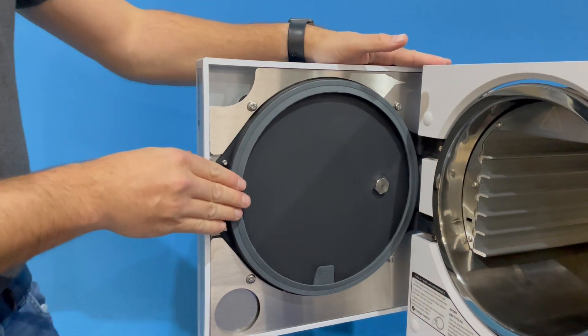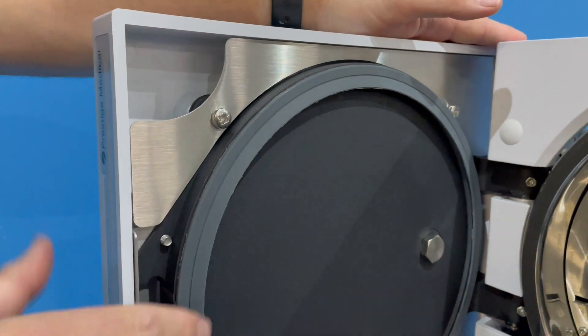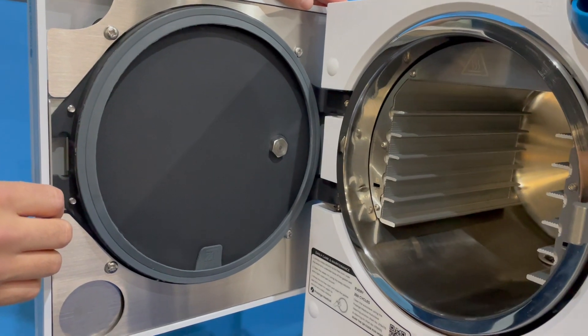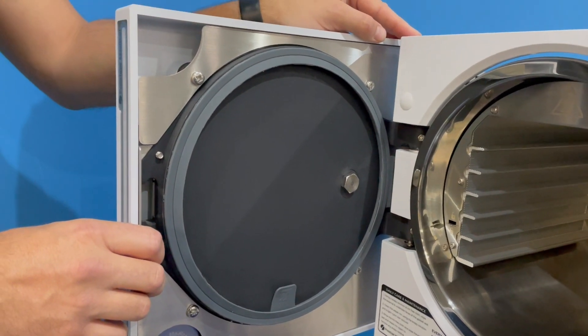And that is now okay. Once you've shut the door and started the cycle, the gasket itself will then bed into the actual door. And that is the end of the gasket fitment.